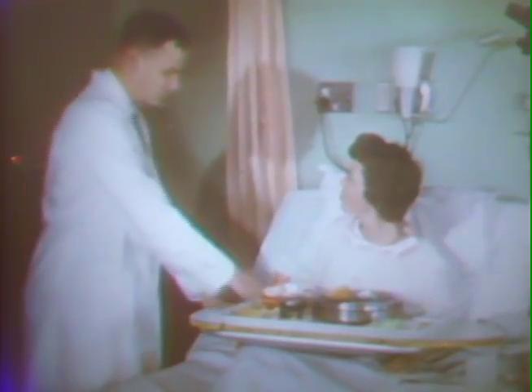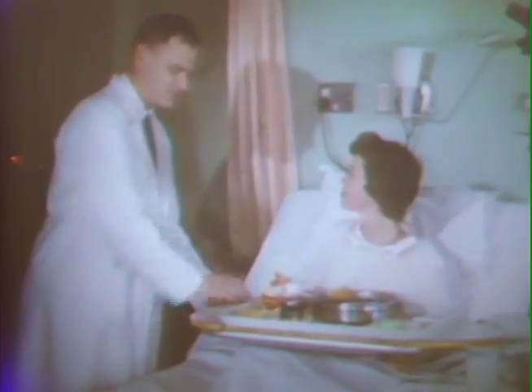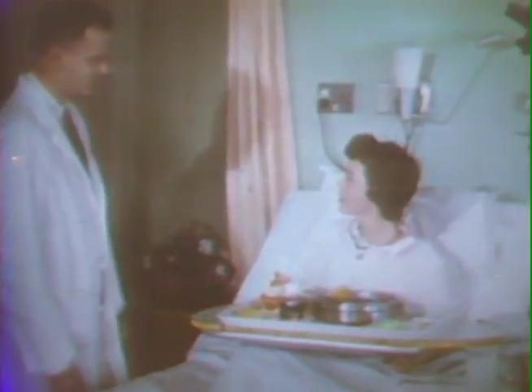The anesthesiologist continues his care of the patient with one or more post-operative visits until dangers of complications from the anesthesia are past. When administered by the skilled anesthesiologist, halothane is a valuable anesthetic agent, potent, controllable, fast-acting, non-explosive, and non-flammable, providing remarkable freedom from nausea and undesirable side effects.